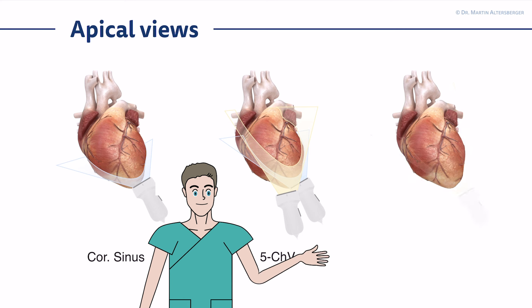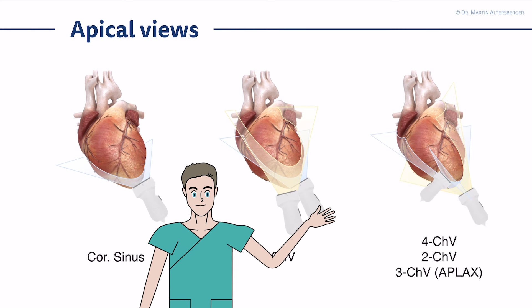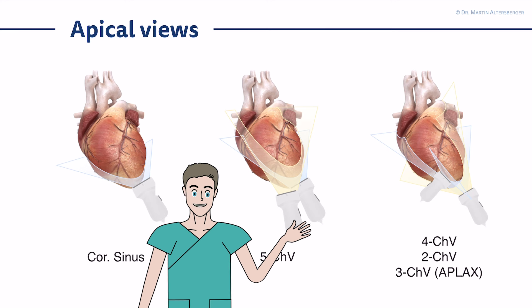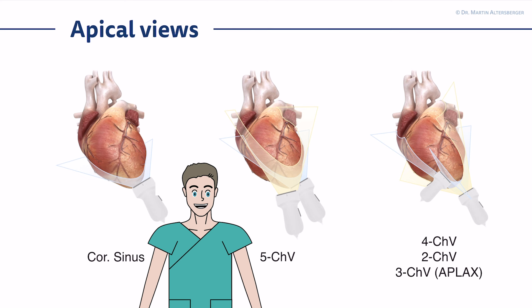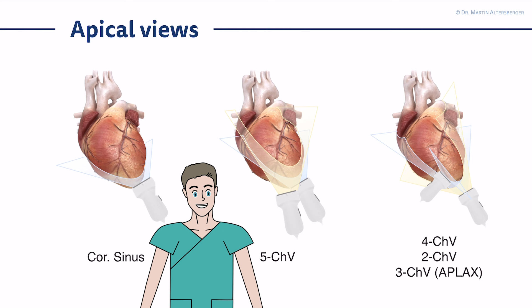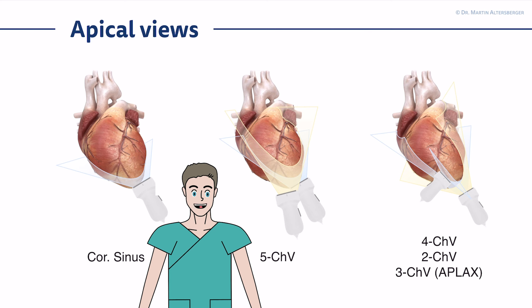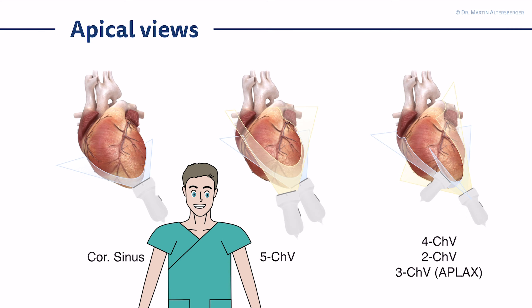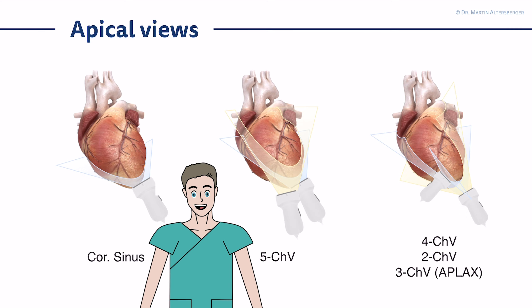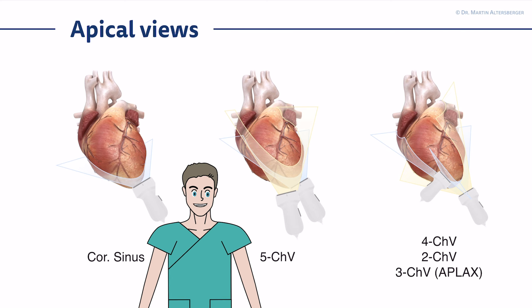In the four chamber view, the marker is positioned left lateral. With a rotational movement you get to the two chamber view and the three chamber view, also called the apical long axis view. You rotate counterclockwise — 60 to 90 degrees from the four chamber view to reach the two chamber view, and approximately 30 more degrees to reach the apical long axis view. Tilting the transducer more steeply gives you the aortic valve and the five chamber view, while tilting the other direction gives the coronary sinus view.